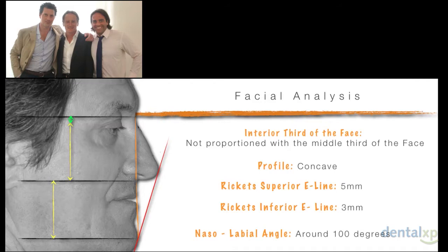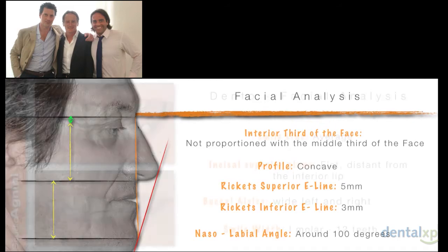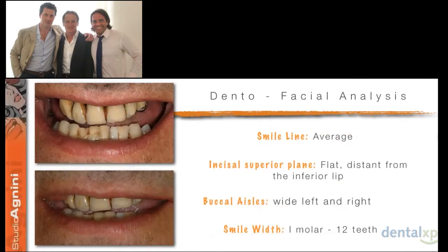All of this information is written on a static chart and on a lab chart that we have in our office, which is done for every single patient. Then we send this chart to Luca, so he can use this information to help us give a correct hypothesis of treatment plan for this patient.